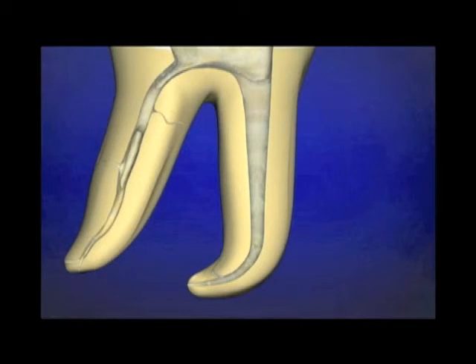Well, well-shaped canals are a great opening for disinfection, but wait a minute, I almost forgot, we have a post-op film. This isn't complicated. This is simple kinds of shapes, not so complicated, little bit of curvatures. You can see some anastomosing. Maybe there's a little offshoot in the mesial root, but big deal. Clean shapes that can be achieved through glide path management and shaping concepts.